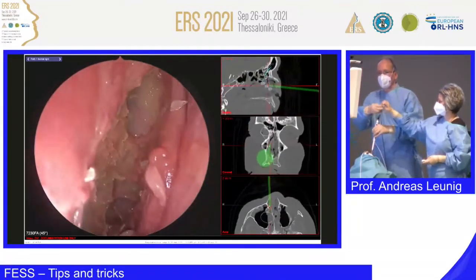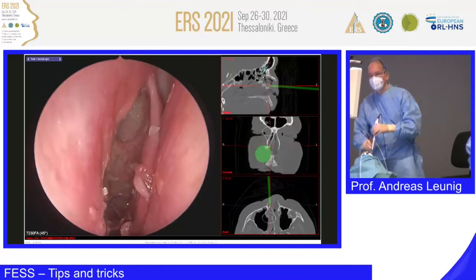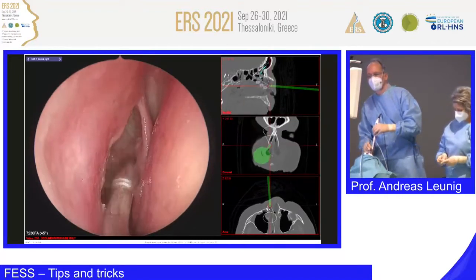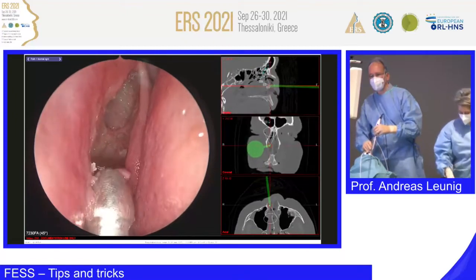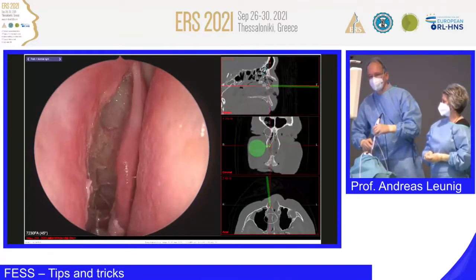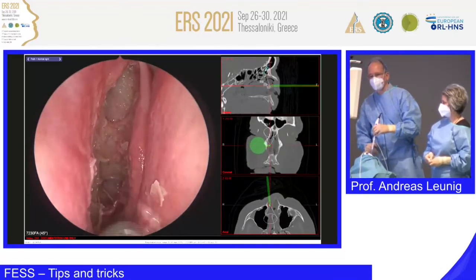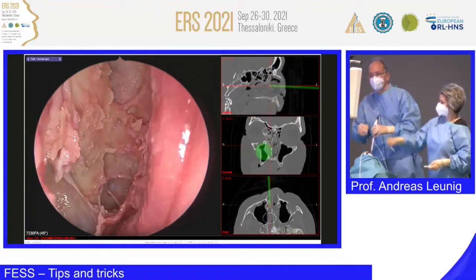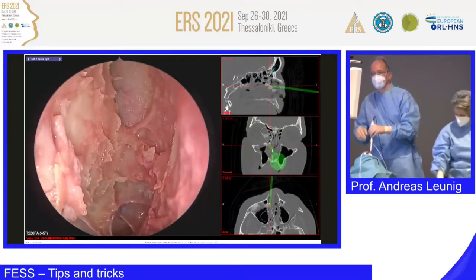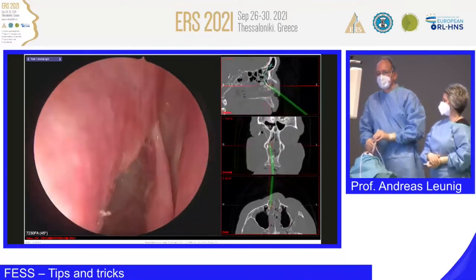Now have a look inside. We're sucking out the debris. Showing you how it looks when it's widely opened. Here are some tiny bony lamellas. We leave them there. It's a wide opening. You could do a little bit more there. You see the artery, you see the sphenoid sinus, skull base. It's not polished 100%, but that's what we don't do. That's the entrance into the frontal sinus.